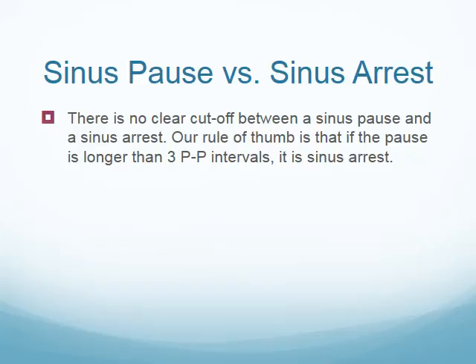Like I said, there is no real clear-cut difference between sinus pause and a sinus arrest. The rule of thumb here that I have in here is 3 P to P intervals. Longer than that is going to be considered sinus arrest.